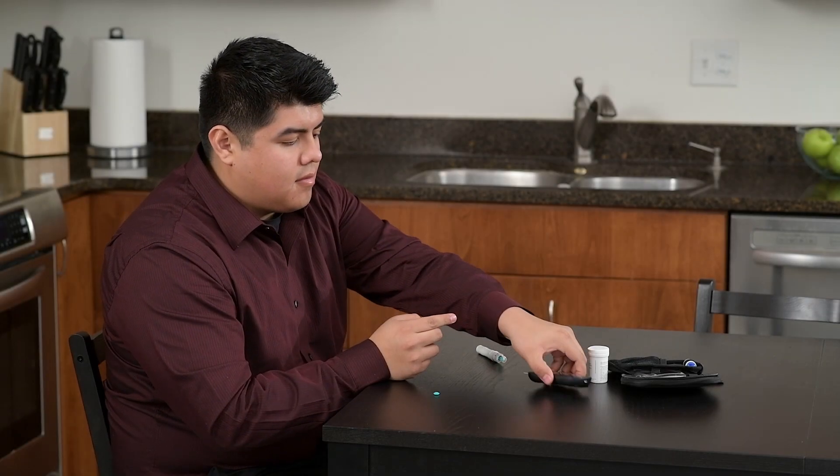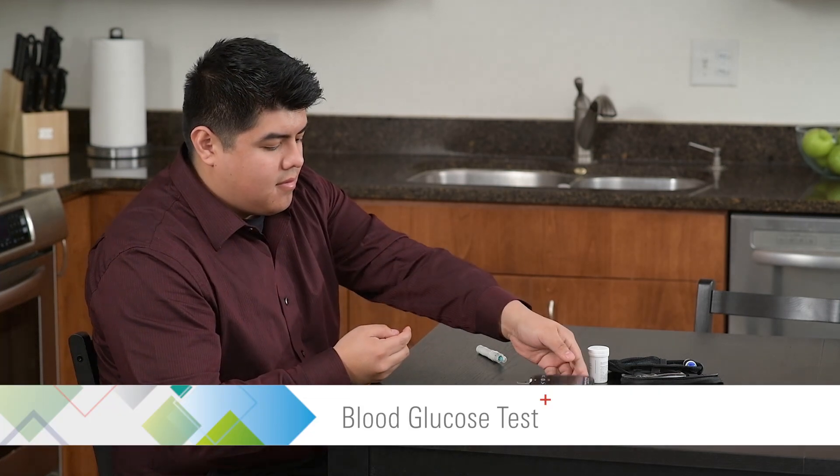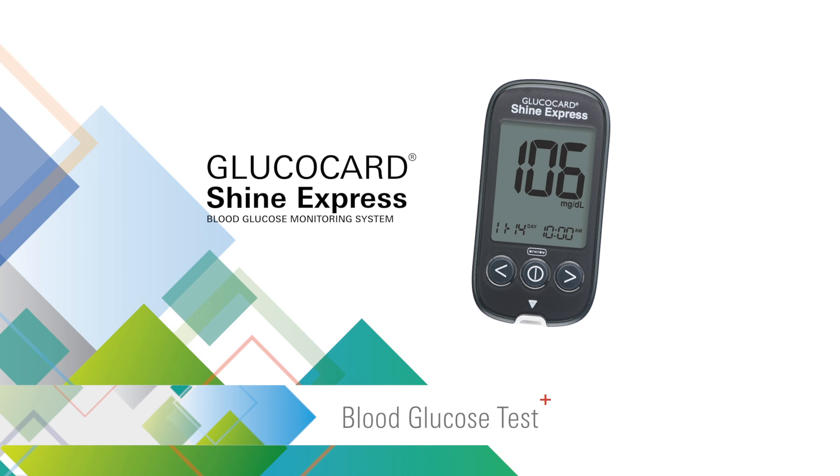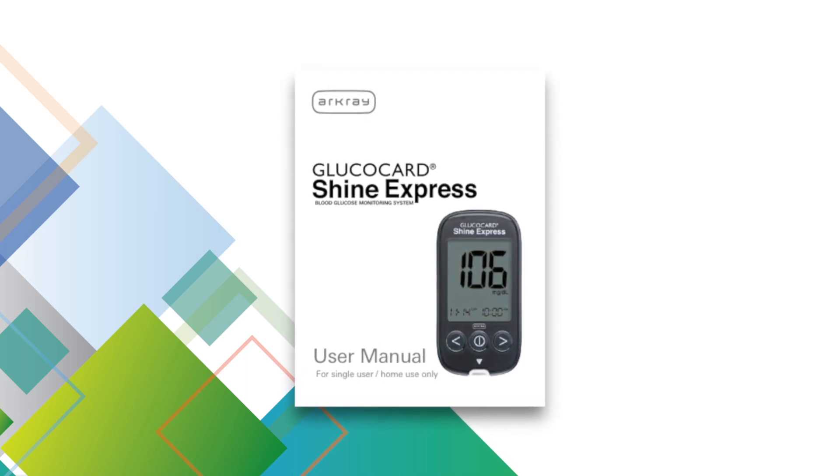This video provides an overview on how to perform a blood glucose test with the Glucocard Shine Express blood glucose monitoring system. For complete instructions, please see the user manual supplied with the meter.